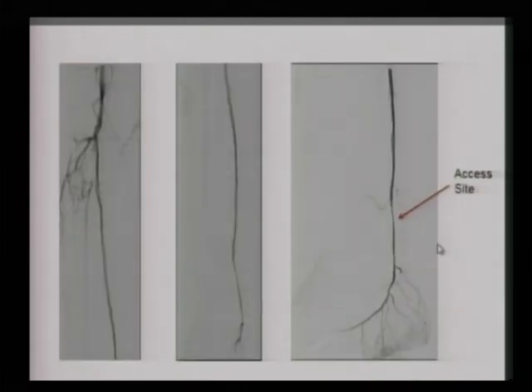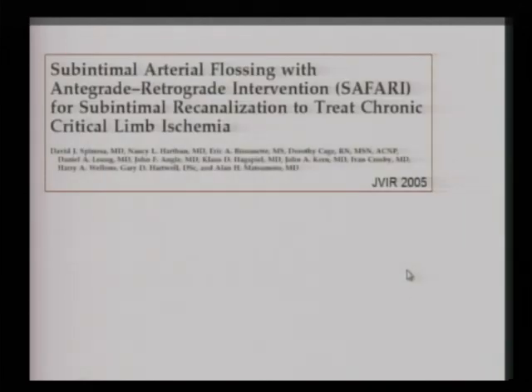This is that particular case. We had a cuff up on the distal leg. You can see that after we've completed the procedure, the patient's still anticoagulated. We have good inline revascularization into the posterior tibial artery. This patient actually went on to heal his wound and his osteomyelitis with debridement and wound care. And you can see there's no extravasation or spasm at the access point.